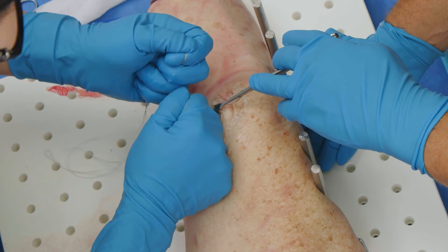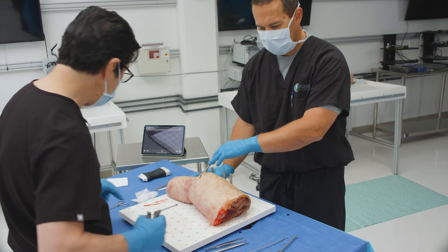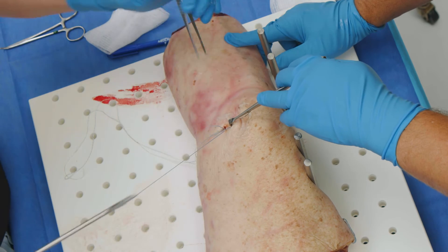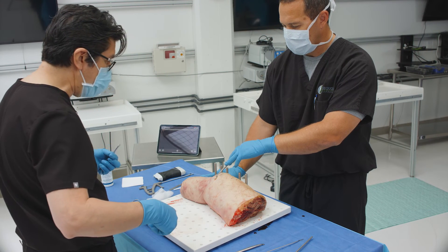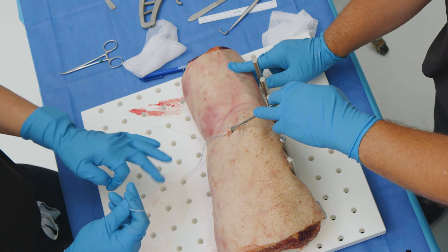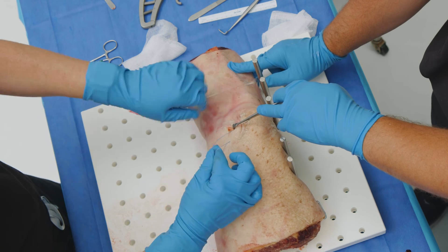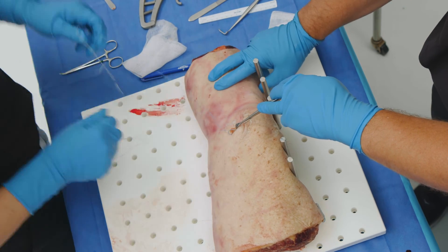This is a knotless anchor, and what's nice is all we have to do now is take our scorpion, take our repair suture, grab the MPFL — which was torn — get under the MPFL, grab the tissue, fire our suture, and we're done. I normally make a horizontal mattress, but for demonstration purposes I'm skipping that. We're going to simply reattach it as a knotless construct. I'm going to attach onto the passing suture at the purple mark, then pull on the other end of the passing suture to set the repair suture into the anchor itself.